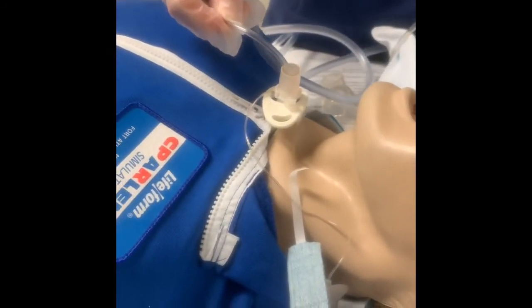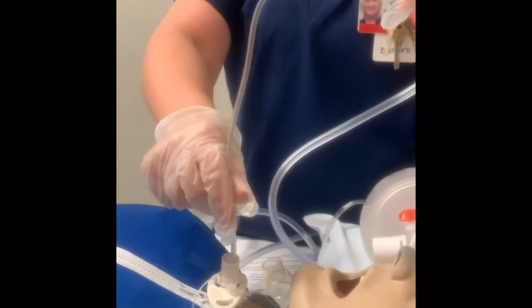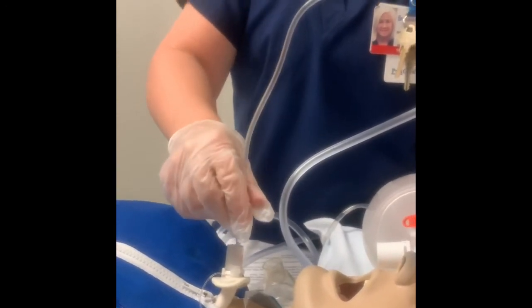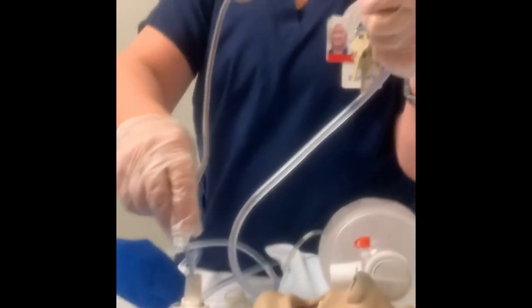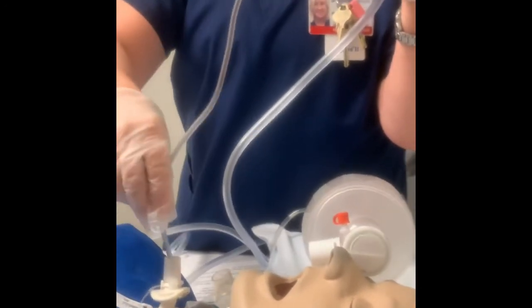And again, what is the max I can have this at? 150, okay? So I'm going to go in. Do not apply suction while you enter. Leave the fingers off the suction. You want to gently insert and don't be too aggressive. Now I've hit resistance. You don't want to keep shoving in. Once you hit resistance, that's it. Pull it a smidgen back. Then I'm going to suction, and you can circle a little bit and suction, and then bring it out.